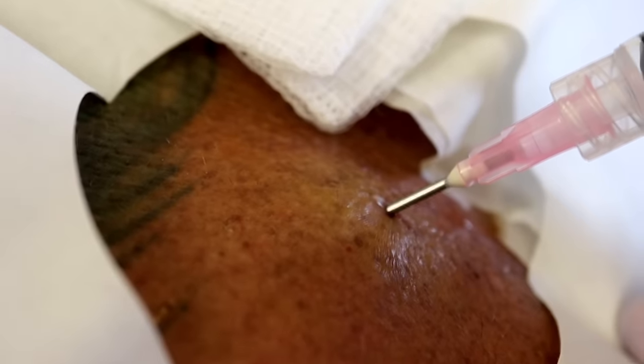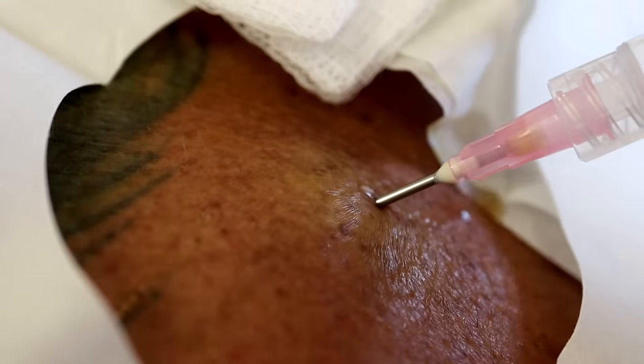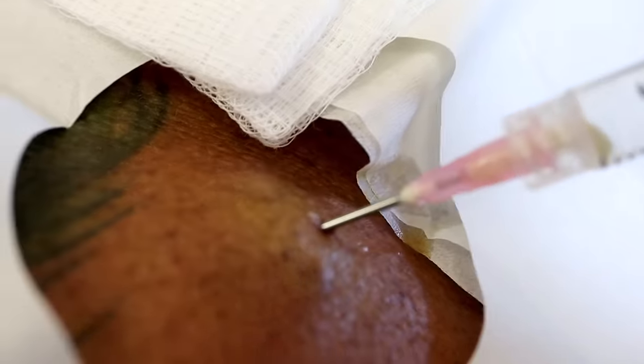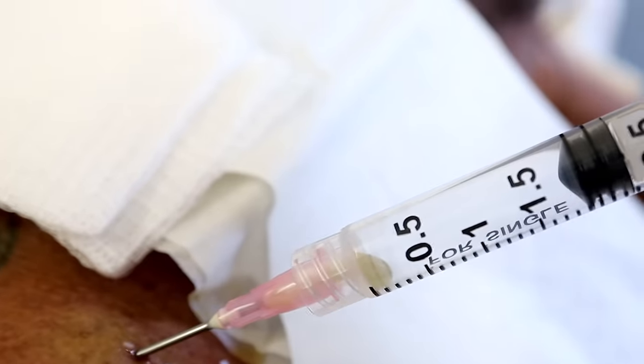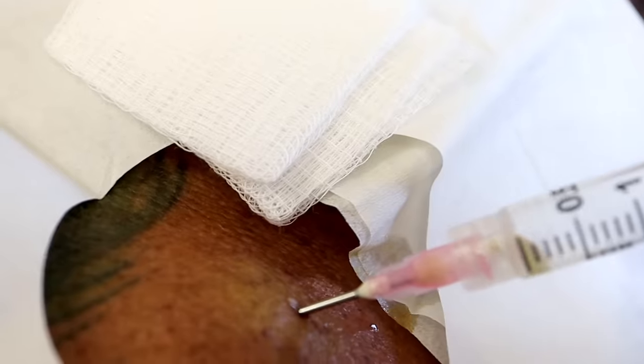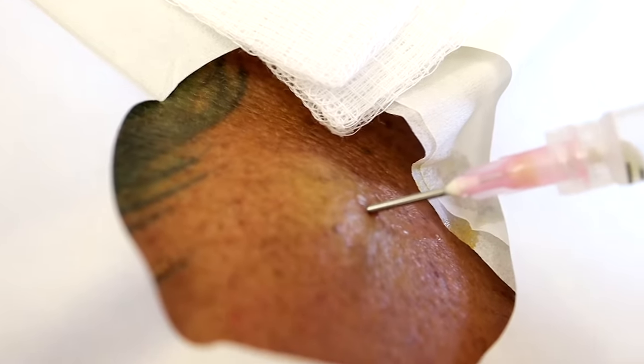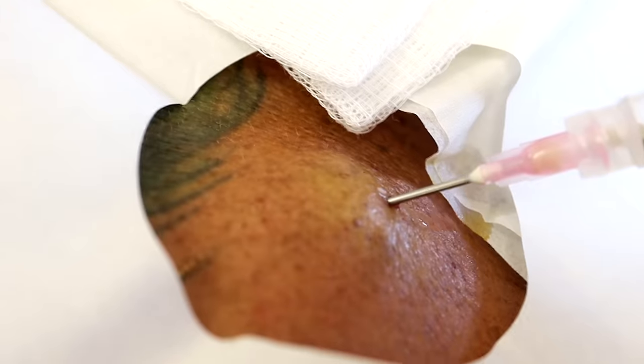Did that hurt? No, I didn't even feel it. So you see, folks? That worked. We're going to draw up and try to get some pus. It's pretty thick — it's not coming. Why don't we do the old-fashioned way?